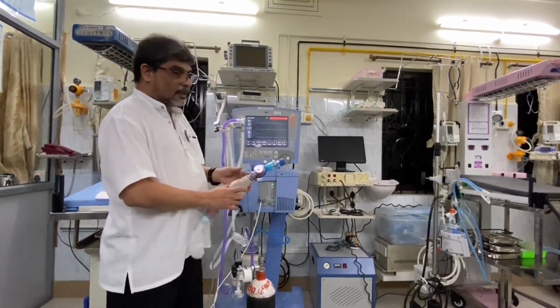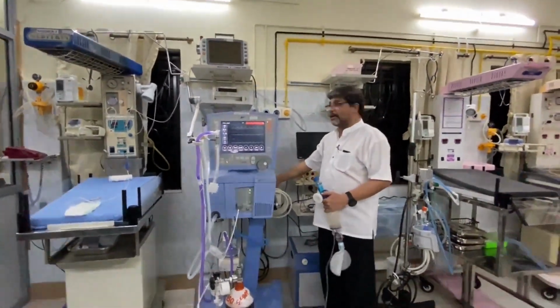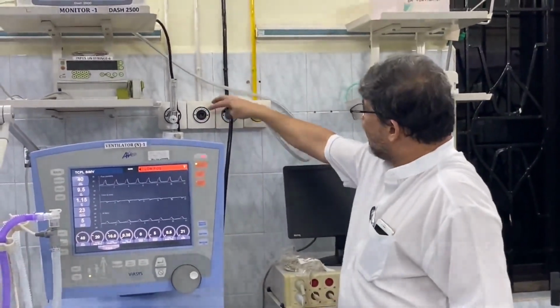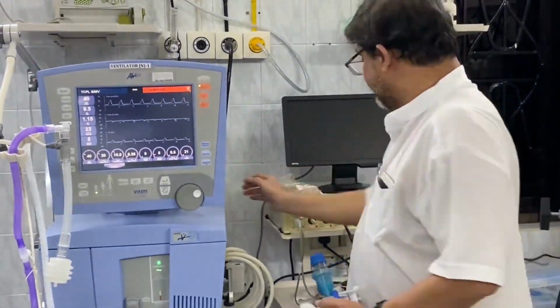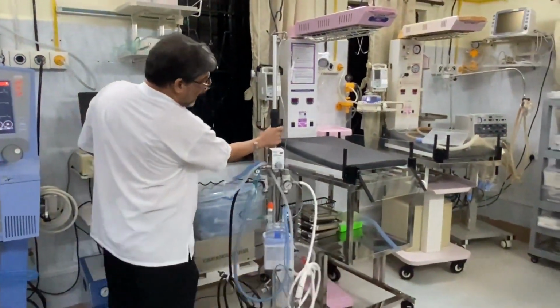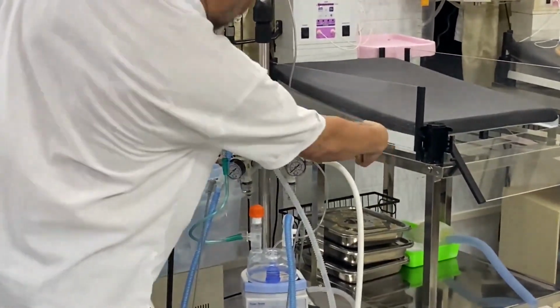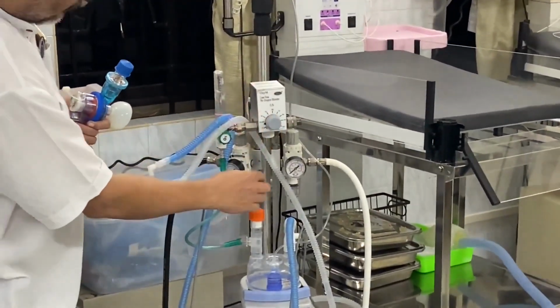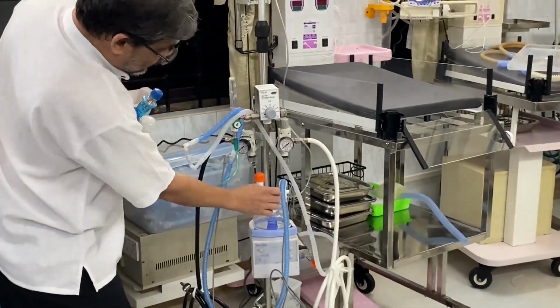What we do is, at the back of the ventilator, if you see, there are two ports connected. One is air and one is oxygen. This air and oxygen go to the back of the ventilator. There is something known as a blender inside it. If you see this machine here, another one, it has got a blender. From the back of the machine, air comes, oxygen comes, the blender mixes the air and oxygen, and then it is sent to the patient through the tubing.